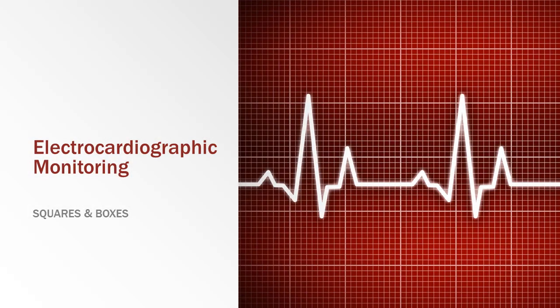Welcome to EKG Monitoring: Boxes and Squares. The reference for this presentation is Brady, Paramedic Care, Volume 4, Medicine, Edition 4. But any book that teaches EKG monitoring will have similar information.